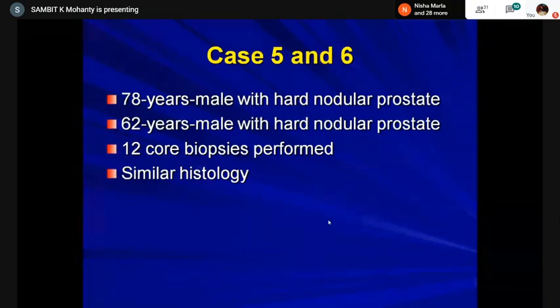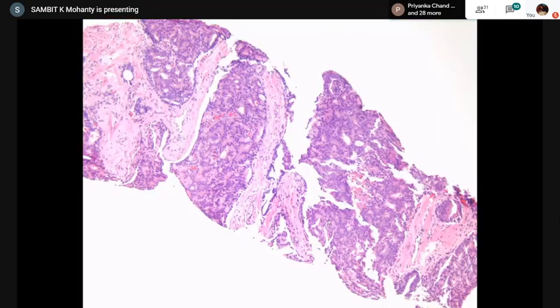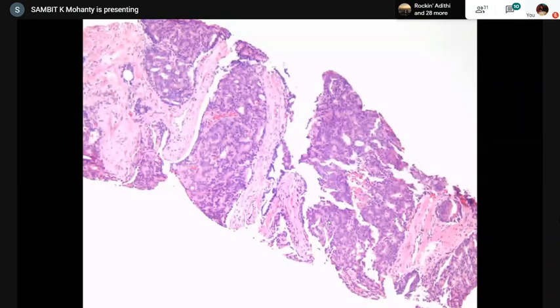Cases five and six: I'll club these two cases together because they have similar history and essentially similar morphology with little variation. Both presented with hard nodular prostate, high PSA, and 12-core biopsies were performed. In case one, all cores were involved with high extent. We have cribriform structures — they look like cribriform structures with holes, solid areas, and circumscribed cribriform structure with a pushing margin, not infiltrating into the stroma. Clear interface with the stroma, hardly any desmoplastic reaction.